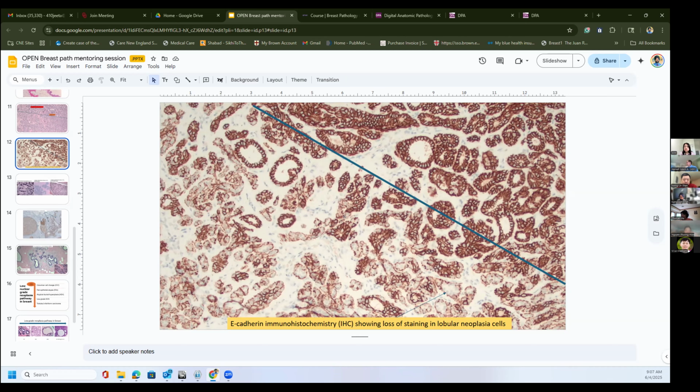So that tissue has undergone an additional step of freezing that leaves an artifact. And when you look at it under the scope as a permanent section, you can tell, oh, this tissue was frozen. So as you go through training, you look at more tissues, you will train yourself to tell these artifacts of autolysis because of poor fixation or frozen section.